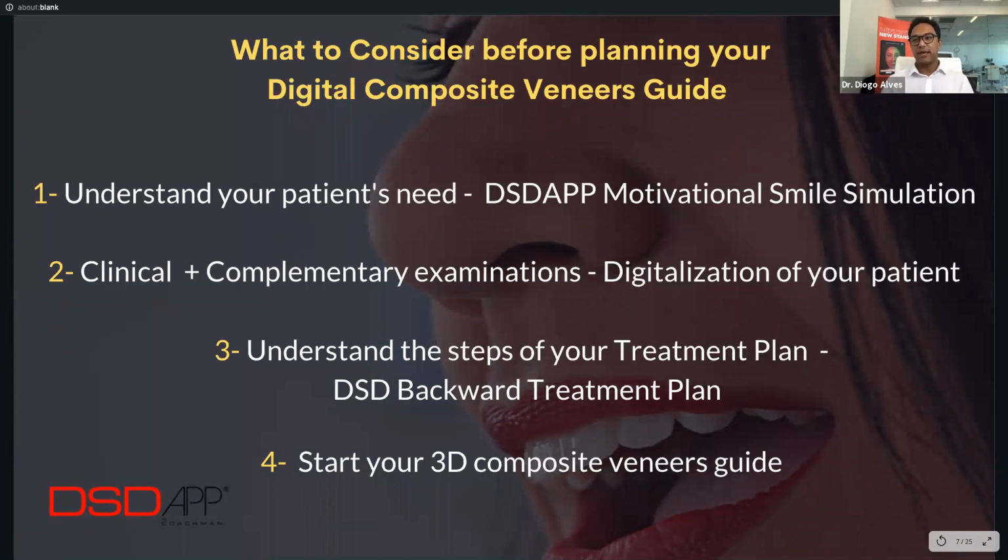And this is something that if you guys want to take a screenshot, if you want to take a picture of it, because this is really important, not just for aesthetics, but to any project, to implants, for full mouth restoration. It is really important to excite the patient from day one. So I'm going to show you here an example on how you can do that.